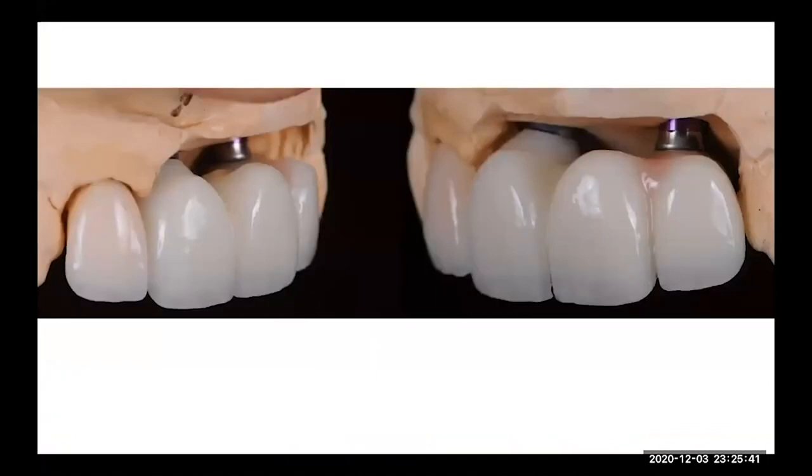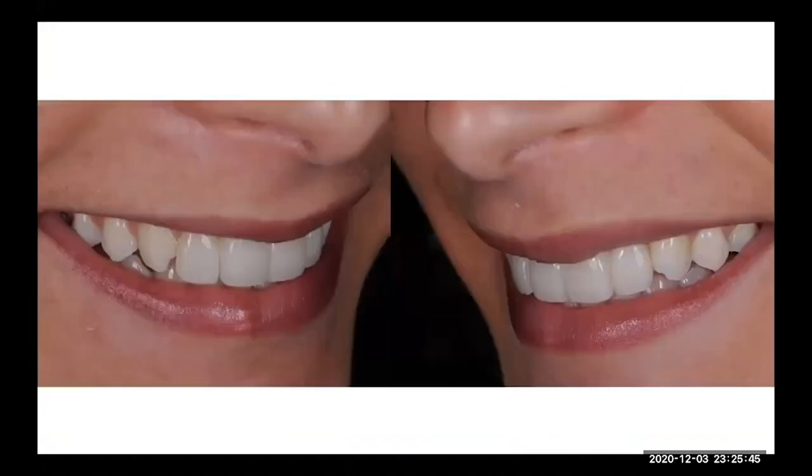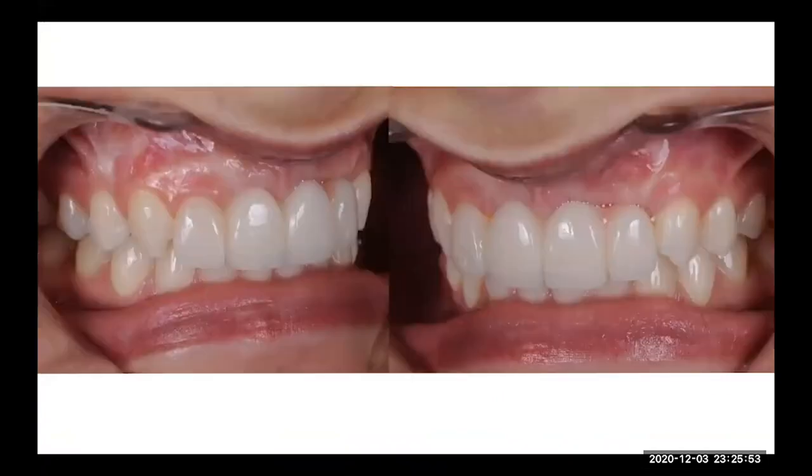We did a 3-unit Emax bridge and 1 single veneer. This is the case in the mouth 2 months later. You can see the soft tissue still needs some work, some regeneration, but I think the result is something acceptable from when we started to now.